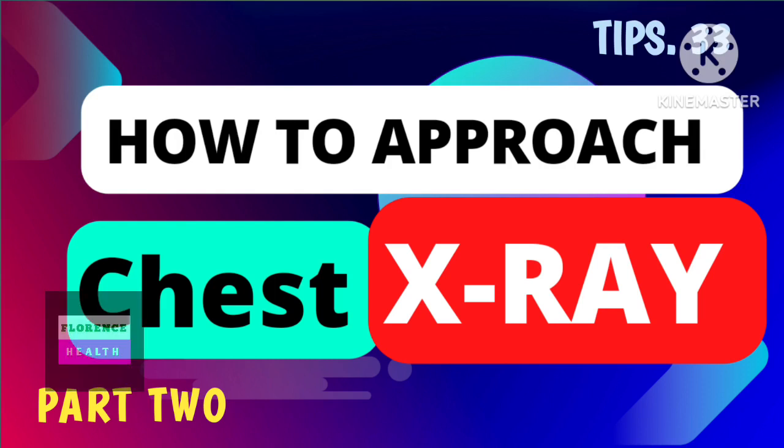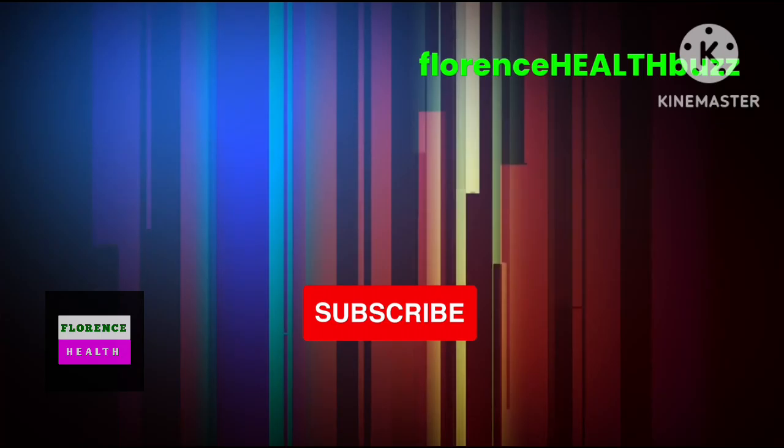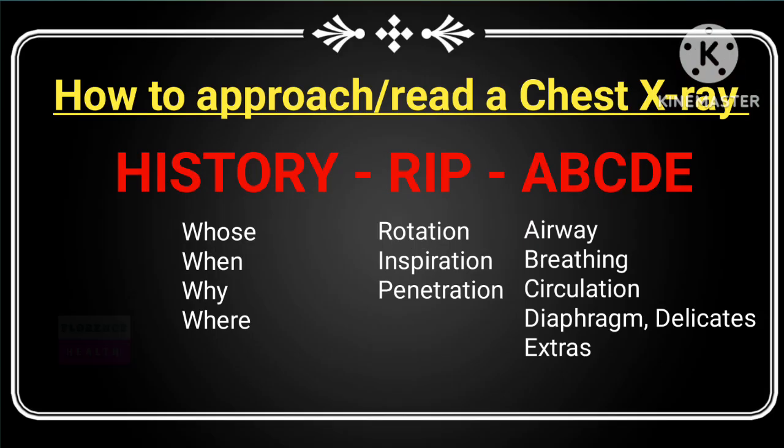Friends, today we will discuss how to approach chest X-ray in part 2. I have already discussed in part 1 about history, that is why, when, where and whose. In this section we will discuss R, I, P: R for rotation, I for inspiration, P for penetration.